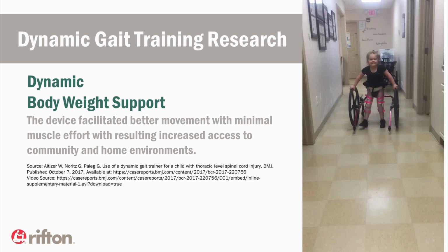This little girl began a walking program 6 months after she sustained a complete T10 spinal cord injury at 23 months old.